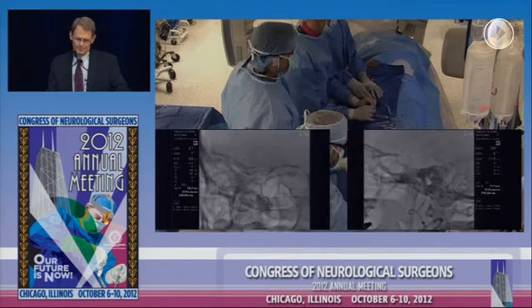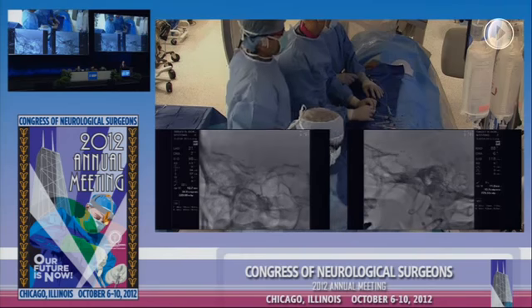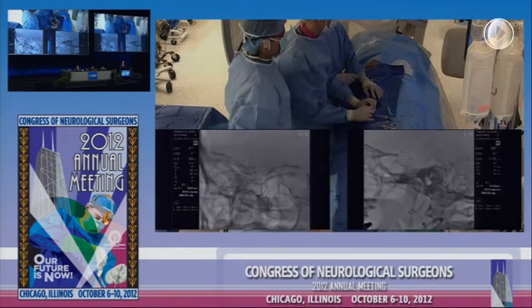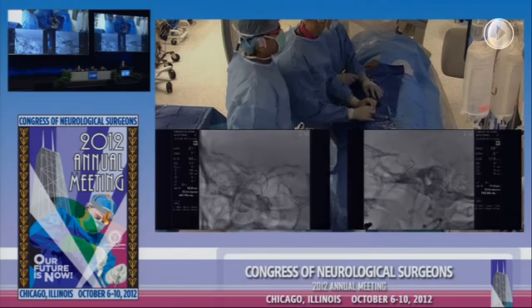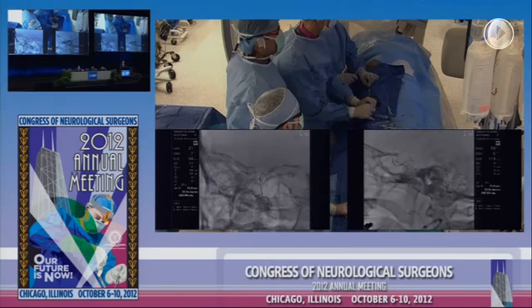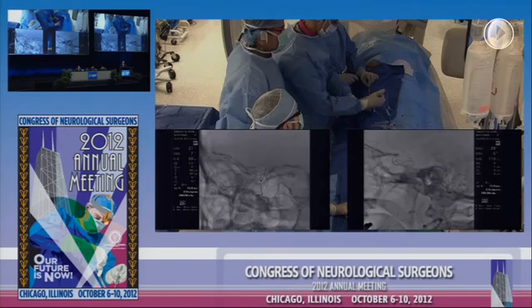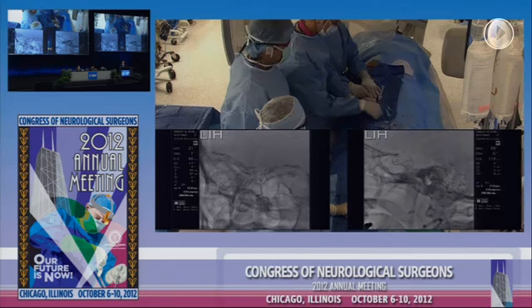You can see the stent coming up now, Nick. You can see there's a lead wire. That's the first tip marker. There's about a 2 centimeter lead wire, which is not the stent. Then there's a nose cone, which basically caps and keeps the stent constrained in the catheter. I think, Paul, you need to enlarge the fluoro image so we can see it better. Let's go on the high zoom, please. Max mag, 1.4 fluoro zoom on the AP, please.